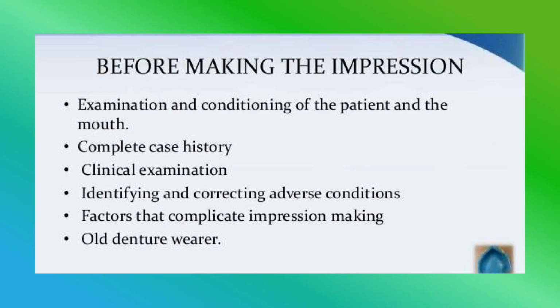Now, before making the impressions, we ensure that proper examination and conditioning of the patient and mouth is done. A complete case history is taken. We do a thorough clinical examination, identify and correct underlying adverse conditions, and we identify the factors that complicate the impression making and find out if the patient is an old denture wearer. If the patient is an old denture wearer, we ensure that the patient removes his dentures 48 hours before impression making for the tissues to come back to their original form.